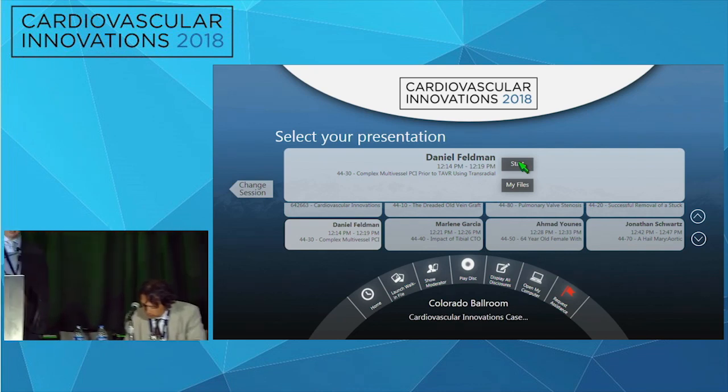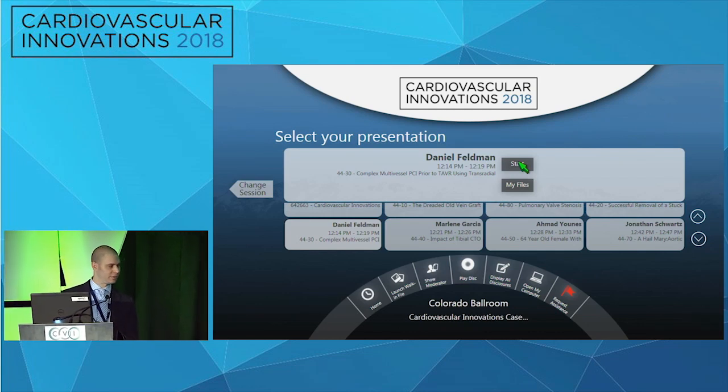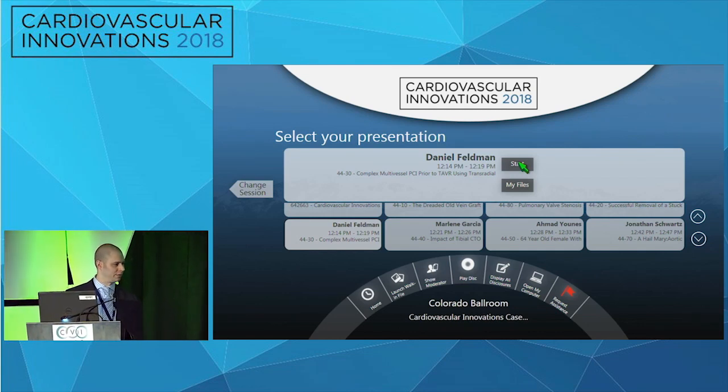Possibly. I think we post-dilated as much as we were going to get. I know it looked a little underexpanded, and there was that aneurysmal segment, so it didn't angiographically look pretty. We didn't IVUS it or image it either, which we could have done as well. But all things considered, I think we thought that was about as good as we were going to get with that.